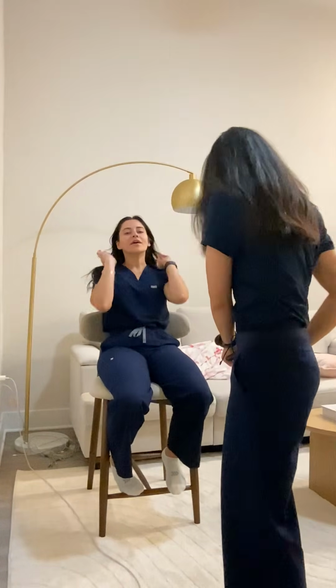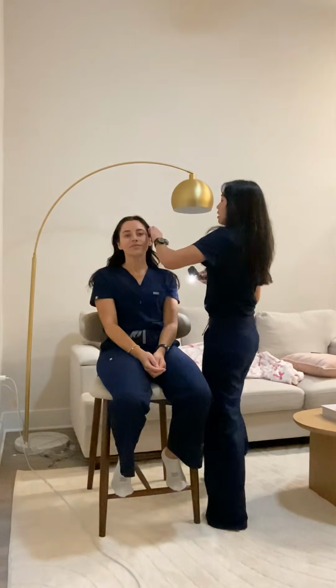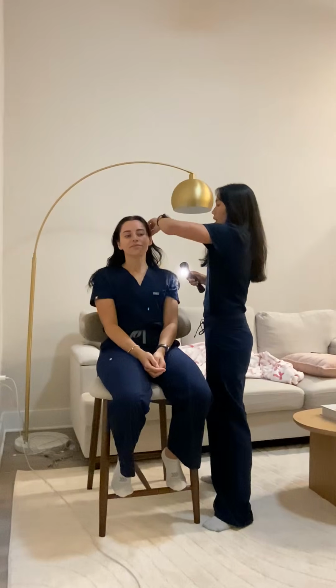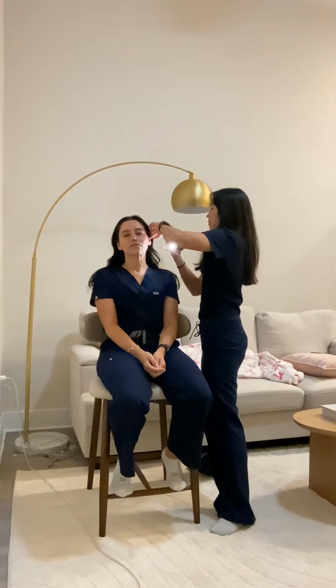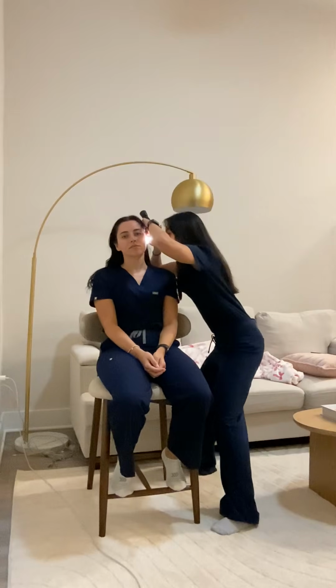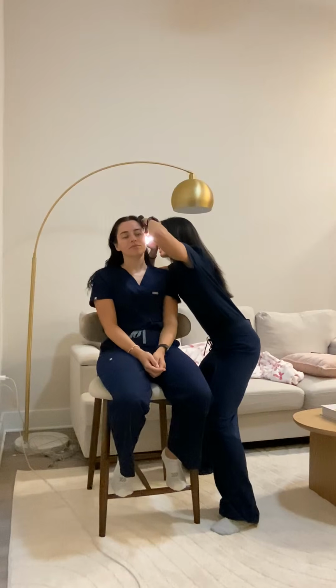Alrighty, now that that is done, now we can begin visualizing the external ear canal. I'm going to pull up your auricle upwards and outwards. I'm going to use my pinky as a fulcrum for stability. And I'm going to visualize the external ear canal. I'm noting for any cerumen. I'm noting for any foreign bodies, inflammation, or edema.